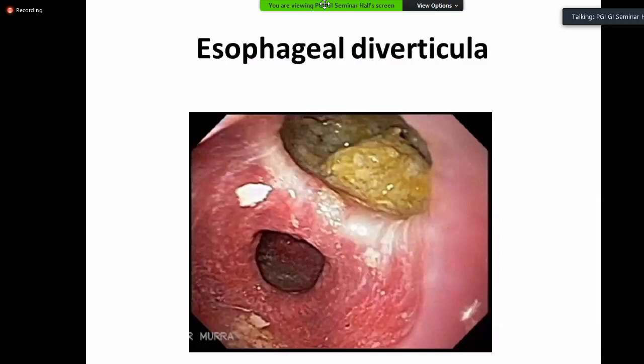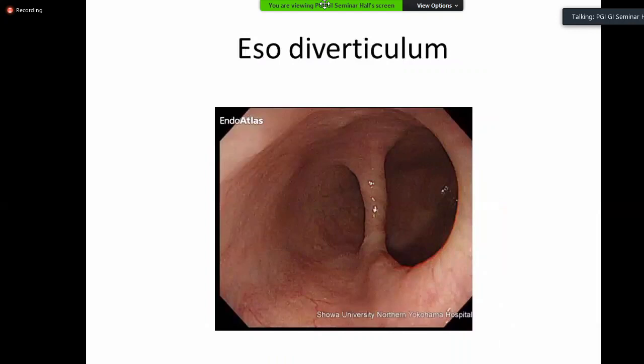Esophageal diverticula clearly seen with full bolus. The importance is that sometimes you may pass the endoscope into the diverticulum if the diverticulum is very big. We had one such patient last week. The lumen was obscured because the diverticulum was full of food material. This is something where you must ask which of the two lumens is esophageal. The other one is the diverticulum.